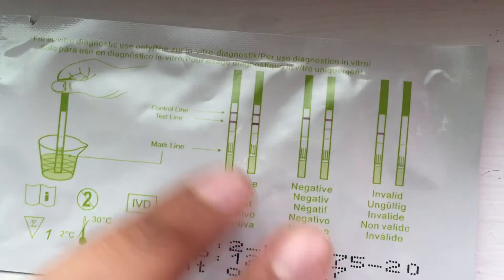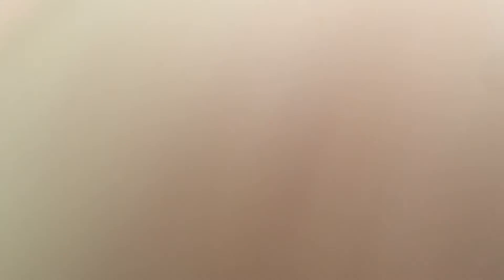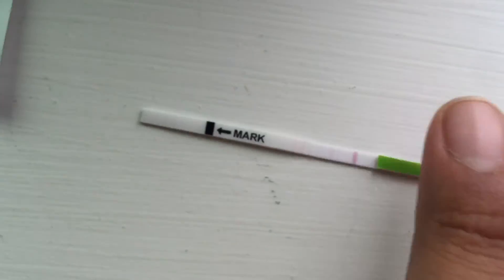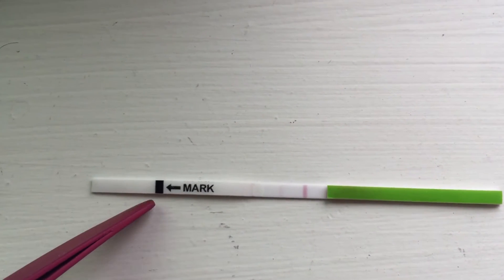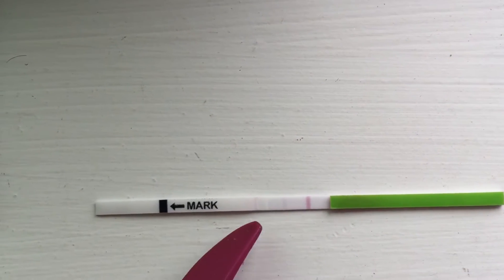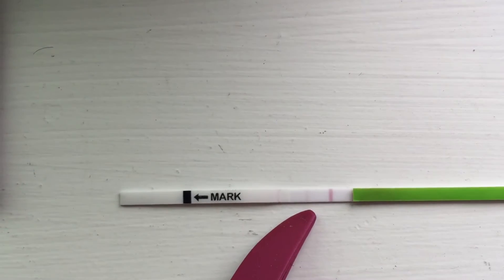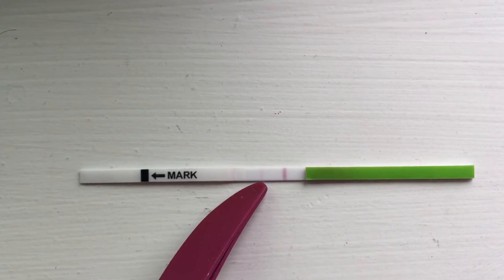Anyways, I'm going to show you guys my results for today. Here, let me just move this. I have yucky fingers from my garden. So as you guys can see, this is the mark where you dip your pee in, this is where you hold it, this is the control line, and this is my result. That is a negative. I am not ovulating.